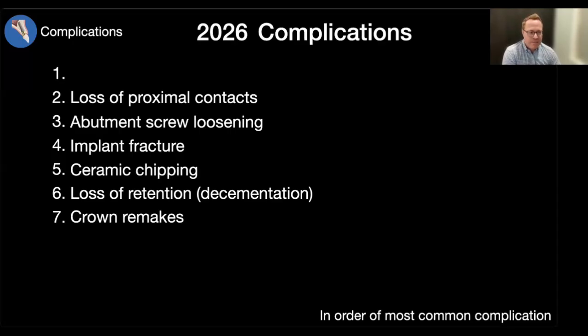It's fascinating to see how that happens so quickly. The number one right now is crown infraposition. We'll go through each of these, but you'll see the first one and the second one are very similar in the range of prevalence with which they can occur. So we'll go into more on that.